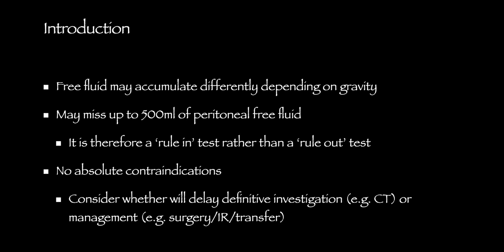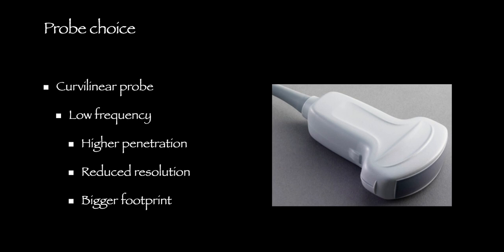There are no absolute contraindications for performing this scan, but just consider whether performing the scan might result in a delay to either further investigation such as CT or management such as transferring to an alternate centre, surgery or interventional radiology. The curvilinear abdominal probe should be used.